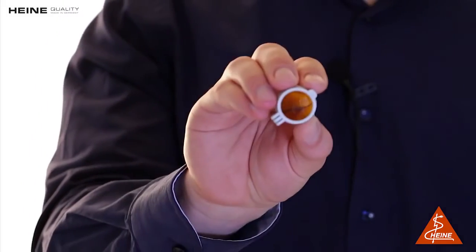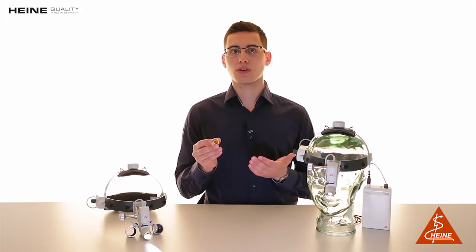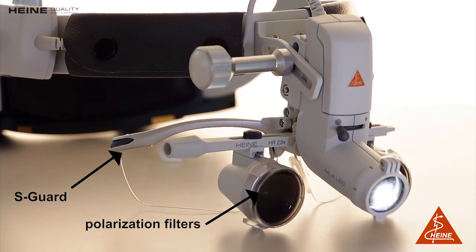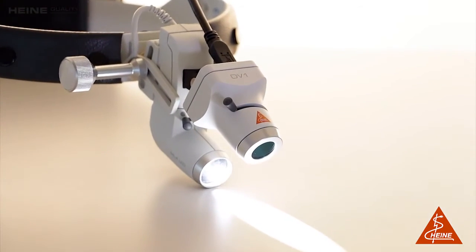Additionally, we offer a yellow filter especially for dentists working with UV-sensitive materials. Of course, the ML4 LED can be combined with the user's choice of Heine Loops, the S-Guard for additional eye protection, polarization filters to reduce reflections, and our DV1 digital video camera offering an extremely well-illuminated video application.